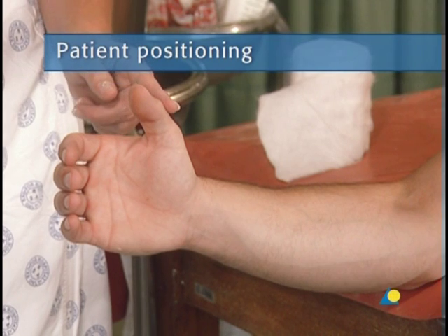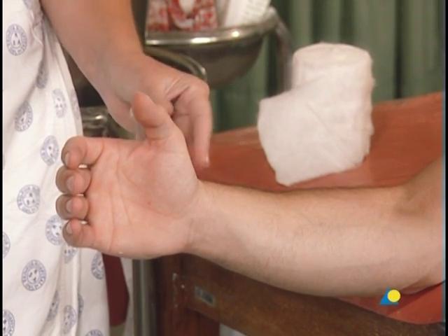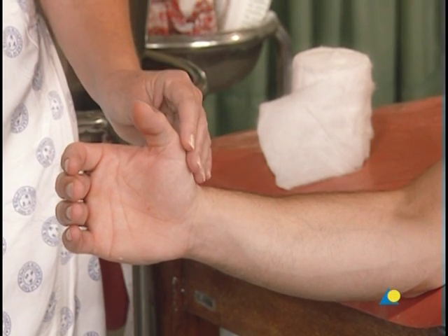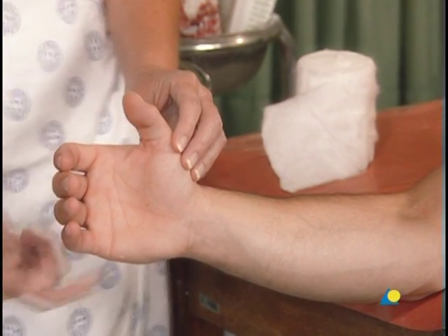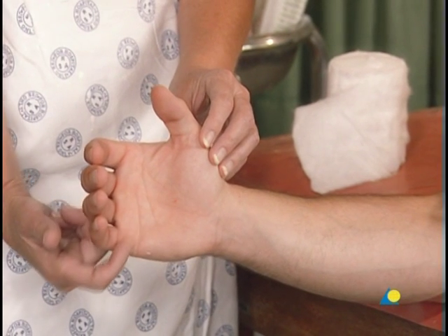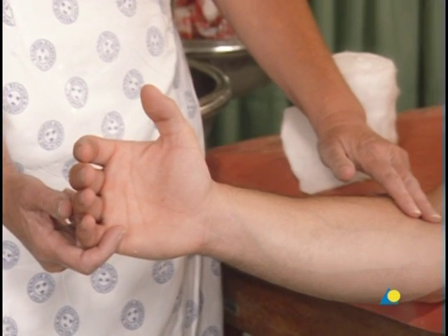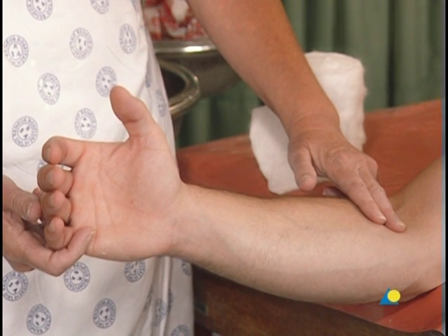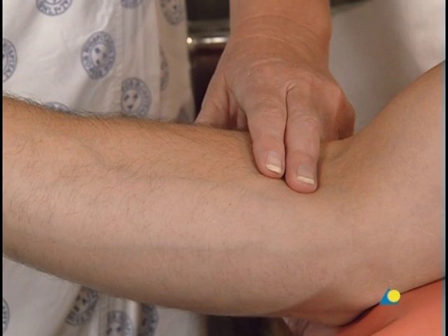The patient should be seated next to a table or trolley, with the elbow at the edge of the table to allow full access to the forearm and wrist. The distal border is located no lower than the distal palmar crease, so that the patient is still able to flex the MP joints to 90 degrees. The proximal border lies about two fingers distal to the crease of the elbow, to allow continued flexion of the elbow.